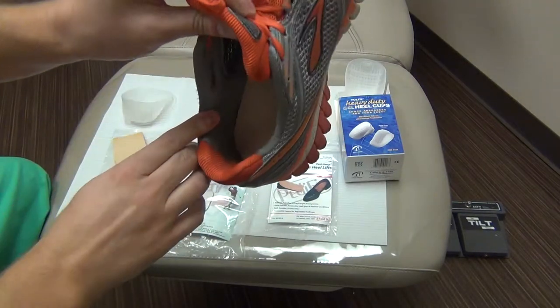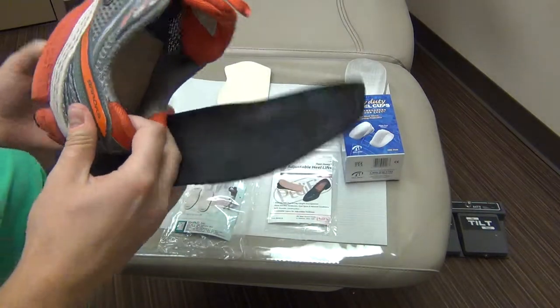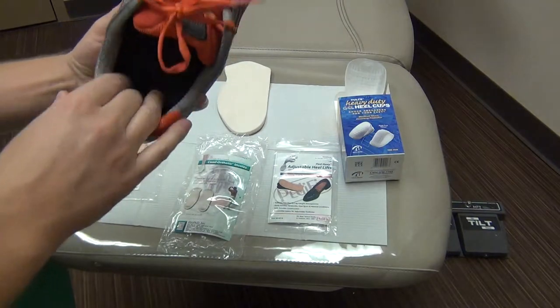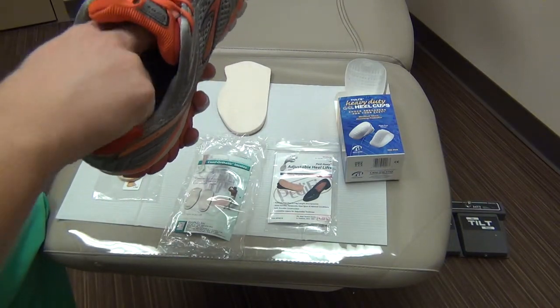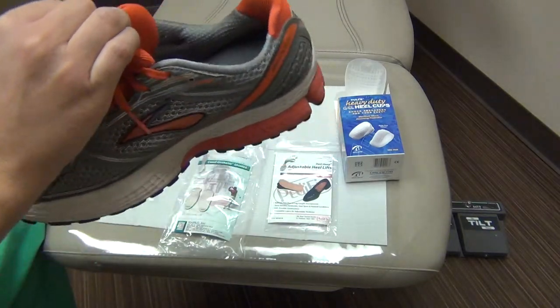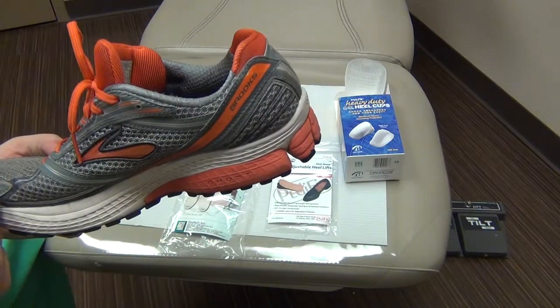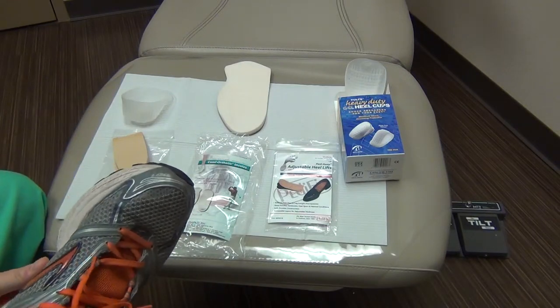I advise that you take this pad, put it in their shoe, and if they just have the liner that came with the shoe, you would put that back on top of the actual heel lift. In this case I have an orthotic because I wear orthotics in my shoes, but typically we wouldn't do both together. The liner that came with the shoe would go over that, so when the patient puts it on their foot, it essentially lifts the heel just a little bit so that Achilles tendon doesn't have so much tension on it. And that is the video for padding for heel pain here at FANT.